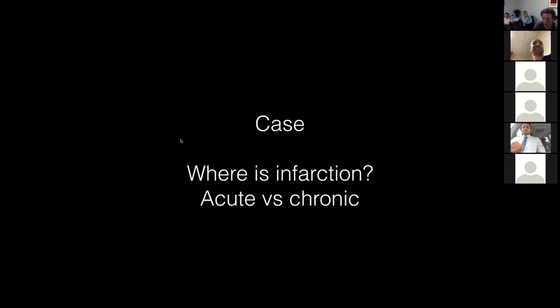Have a look at this. Can you look at some pictures? Yeah. Cool. All right. So the question is, where is the infarct? Tell me which coronary artery territory you think it is, and tell me whether you think it's acute or chronic.